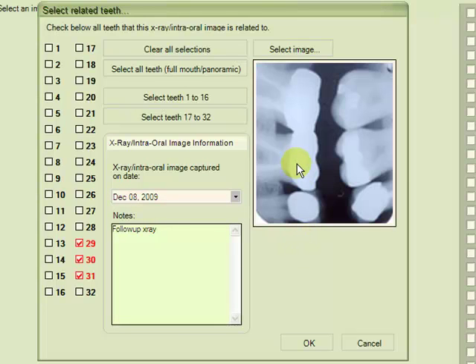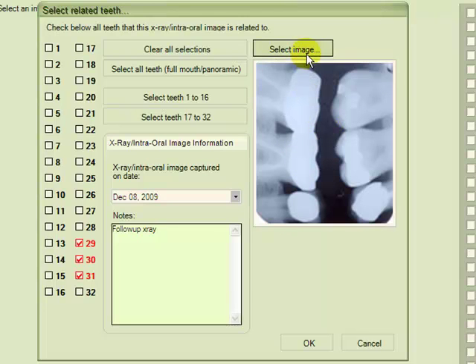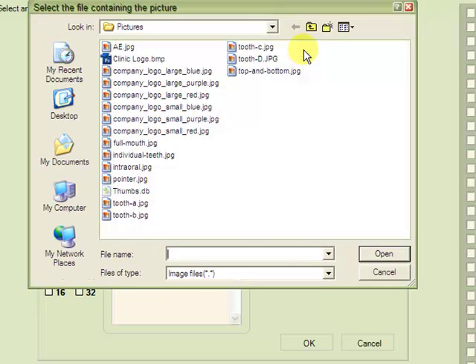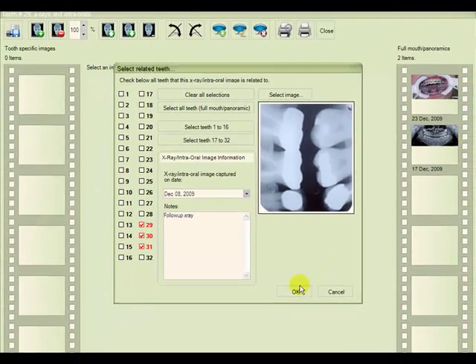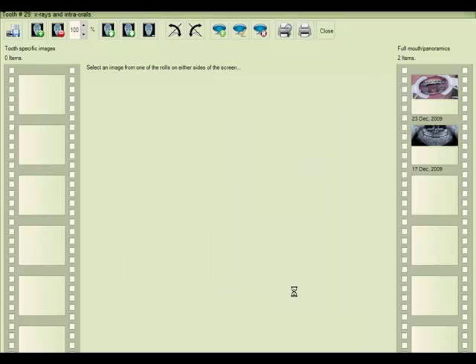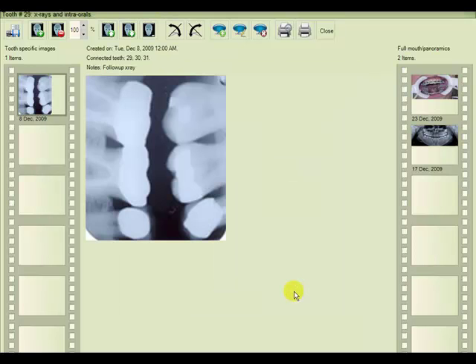And if the image that we see in the window here is incorrect, we could go back to our hard drive and choose another image. When you're done with this dialog, select OK, and the image is now imported directly into the Fields of Code database.